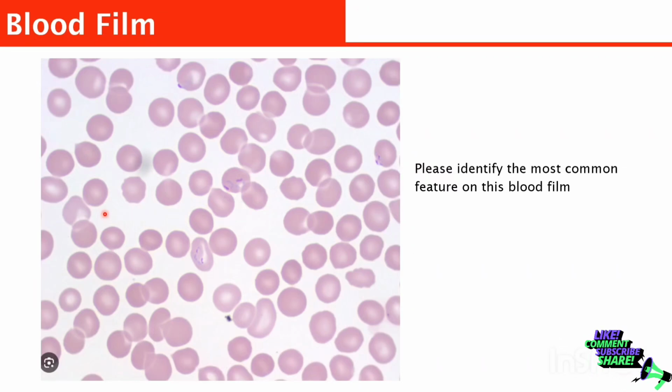Okay, again here. Now, when you see things like this, you are likely to see polychromasia. But I guess the staining is not very clear, you know, if I should call any of them polychromasia. However, what you cannot deny is the fact that some of the sizes of these red blood cells appear very big. So if you look at this, because of the different sizes, some of them appear normal, some of them appear bigger, as the case may be. So we can use a general word if you don't want to say macrocyte, but there are obvious macrocytes here.